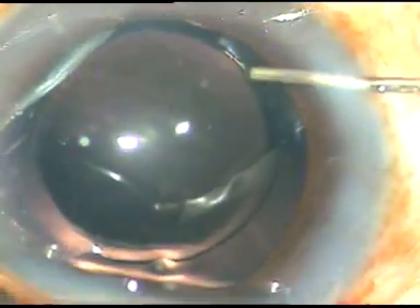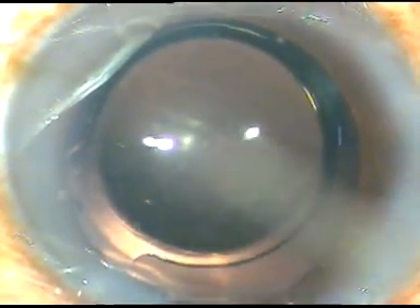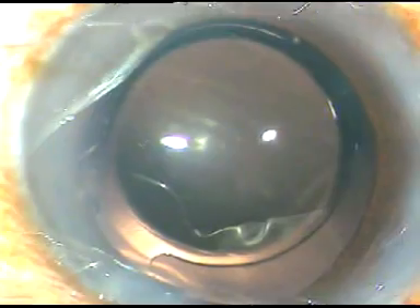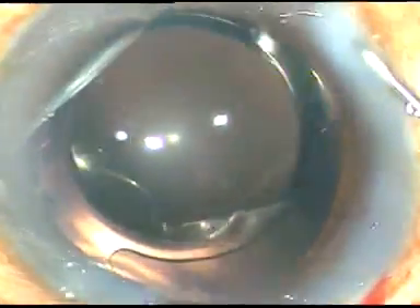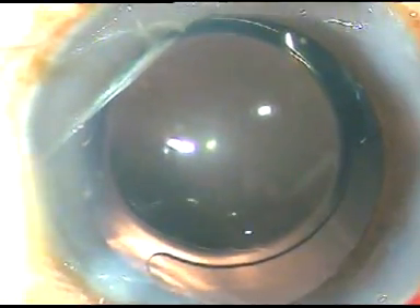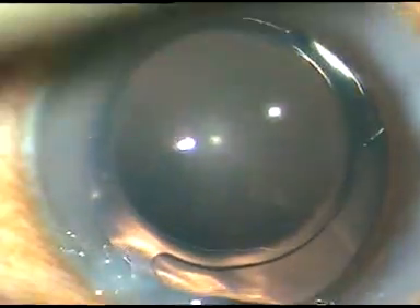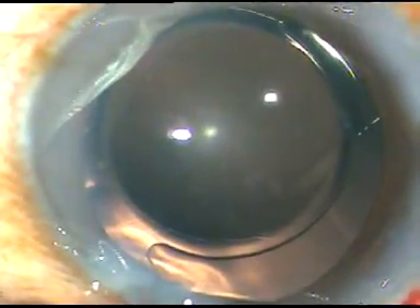This is moxifloxacin. Now the side ports are hydrated to make the wounds watertight. That's it — the case is done. We just have to perform a final anterior chamber lavage with BSS and conclude the case.